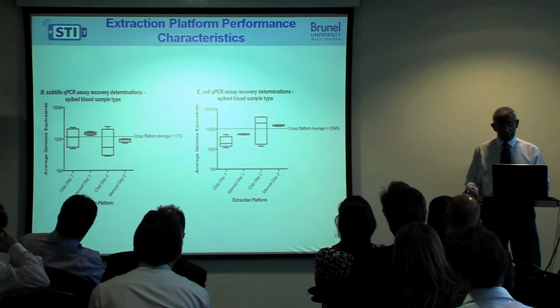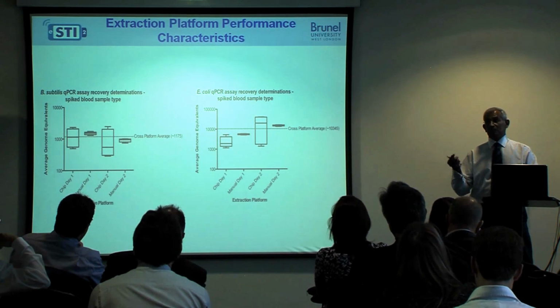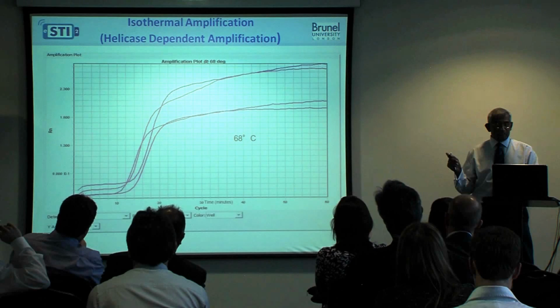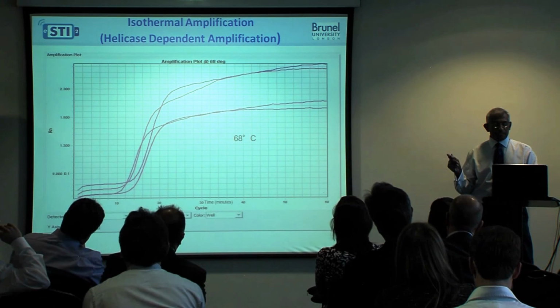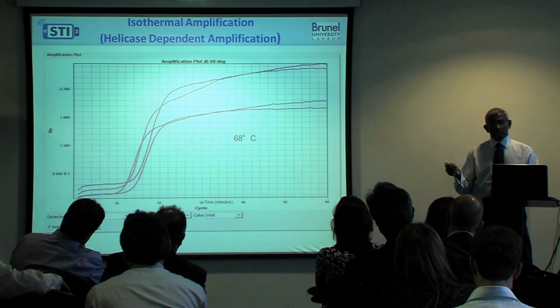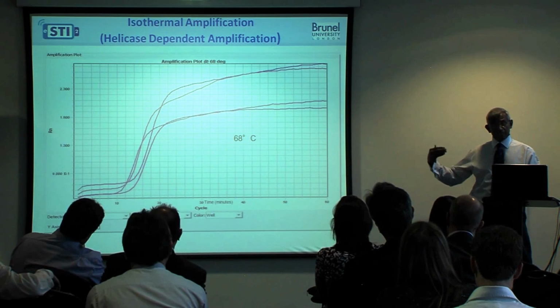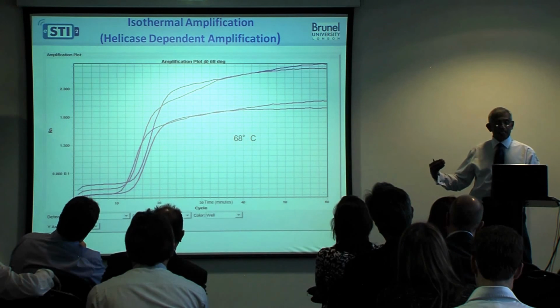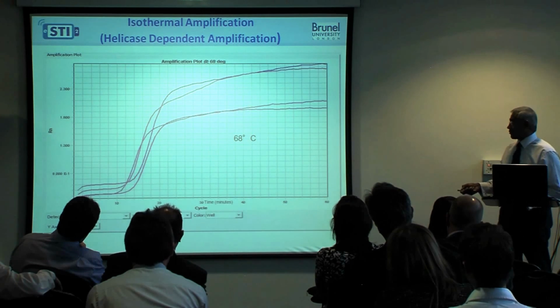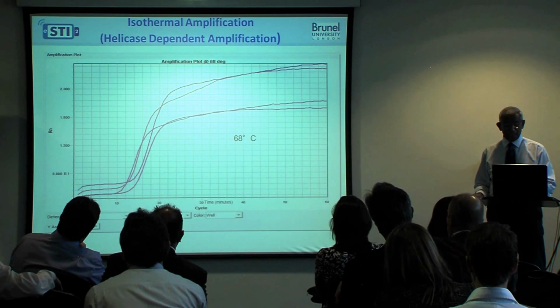Now, of course, in practice, if you extract one DNA, then you can amplify it, and you get millions of DNA, which is needed for the detection. Very quickly, I mentioned isothermal amplification. We've tried to take the normal protocol of the helicase-dependent amplification recipe, and then we modified it to suit the quantities of reagents and the amount of sample we need. And we tested this at 68 degrees, and this is work in progress, of course. It takes about 12 minutes or so to actually amplify the DNA.